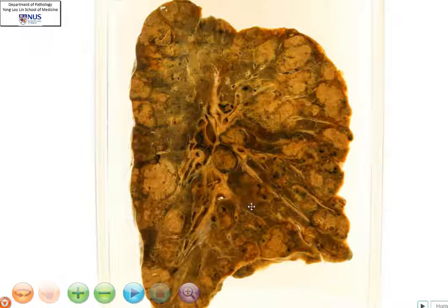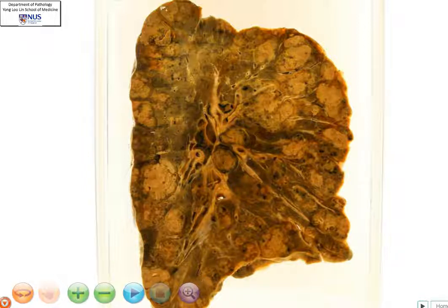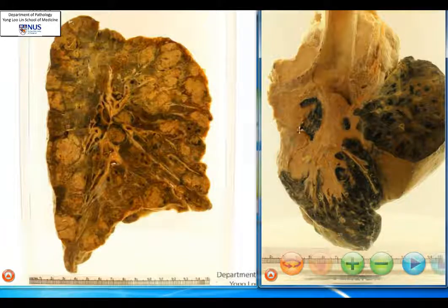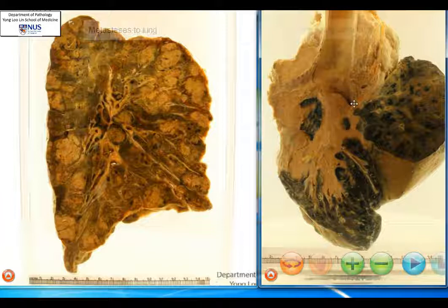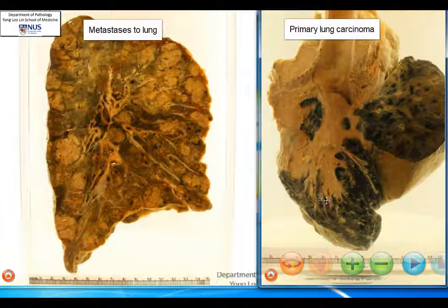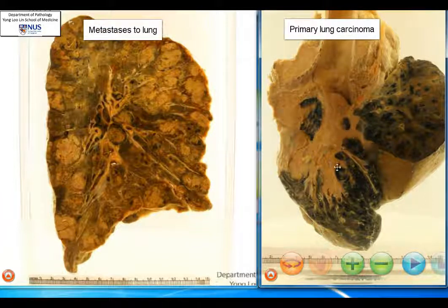In contrast, a primary tumor would show a picture more of a single mass, though not always. For a quick side-by-side comparison, here we have a primary lung carcinoma where you can see that there is actually one main mass.